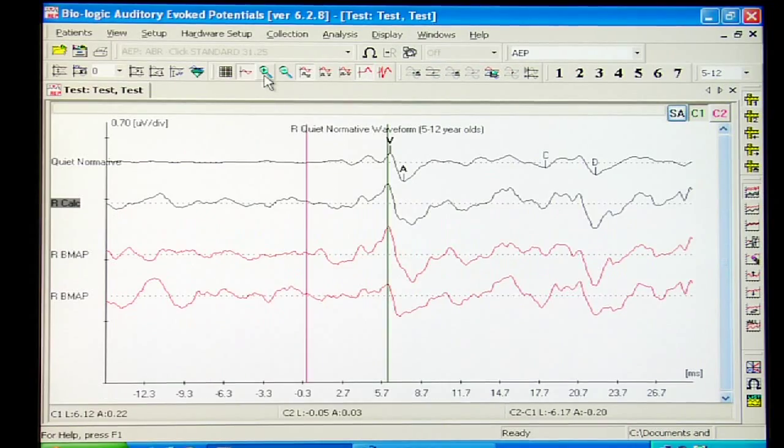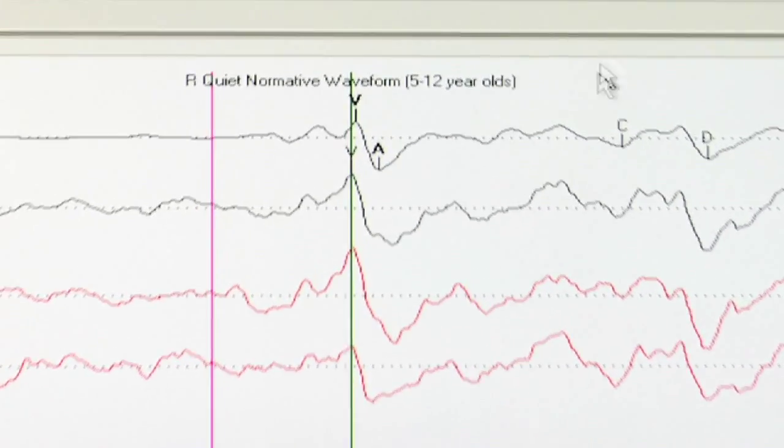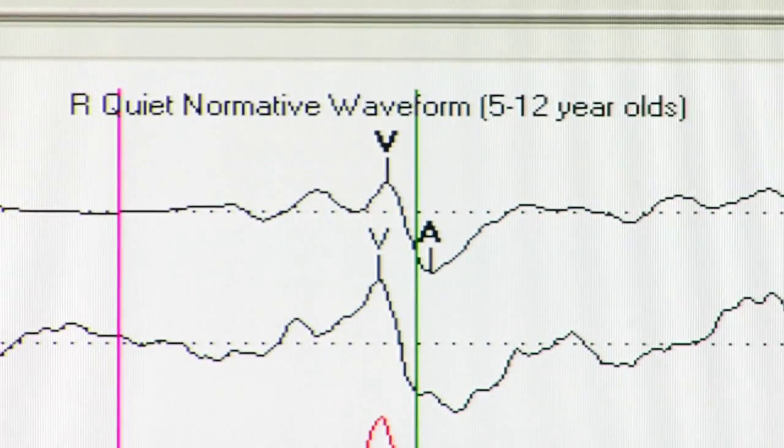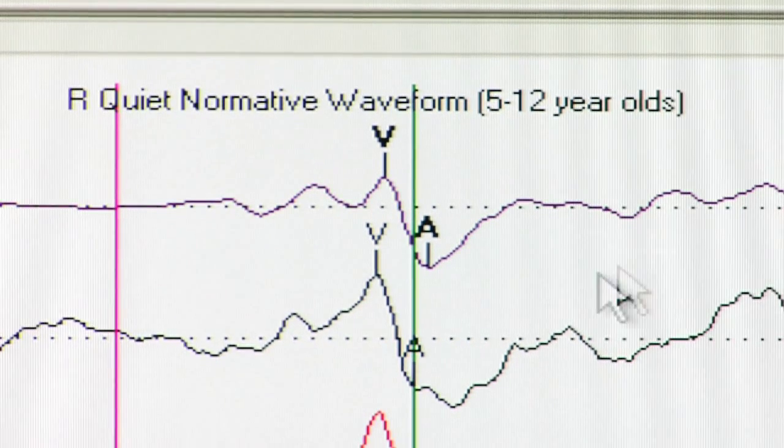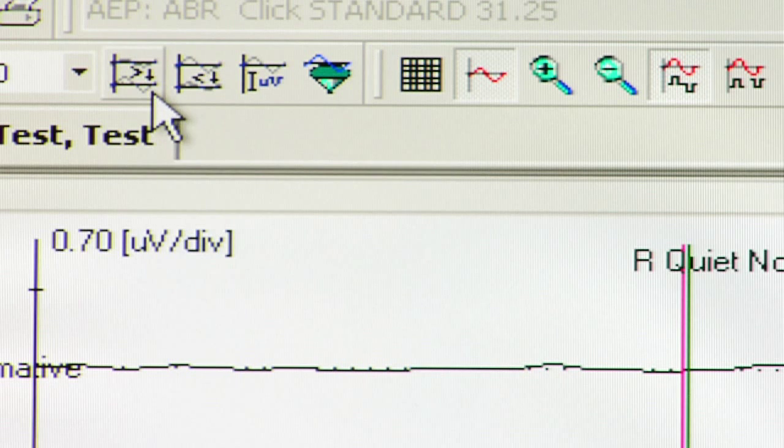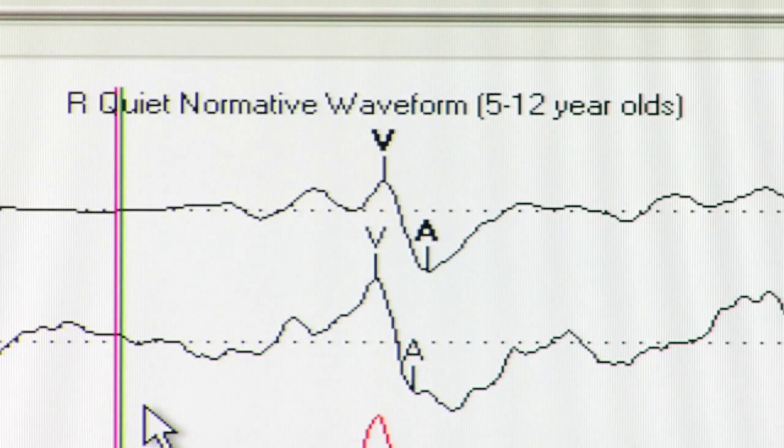These peaks are called waves 5 and A, and they reflect the response to the onset of the sound. Wave 5 occurs at roughly 6.53 milliseconds, and wave A is the trough immediately after 5. Use the template waveform and the two trials to assist you. When marking these peaks, it is important to zoom in both horizontally and vertically to precisely identify 5 and A.